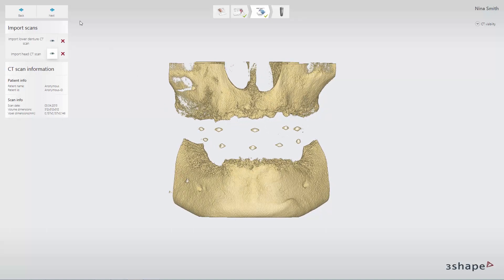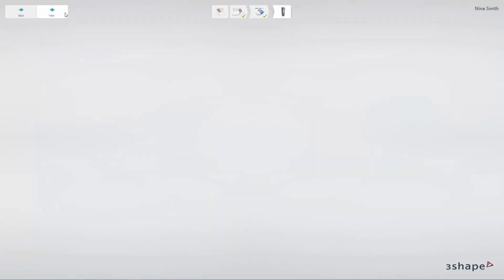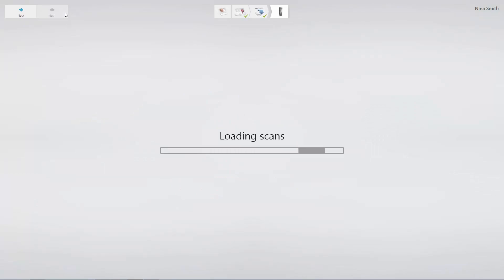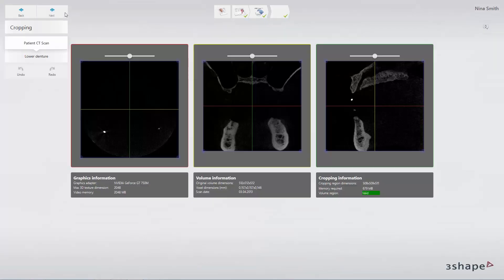When the scans are loaded, click Next to proceed to the main workflow. You have now created an edentulous case.